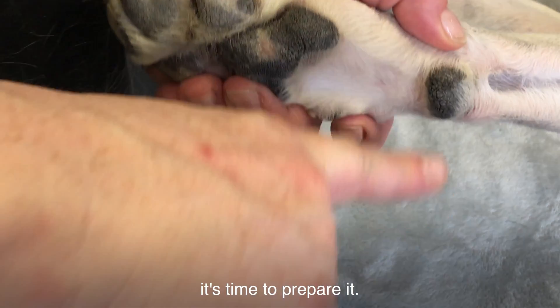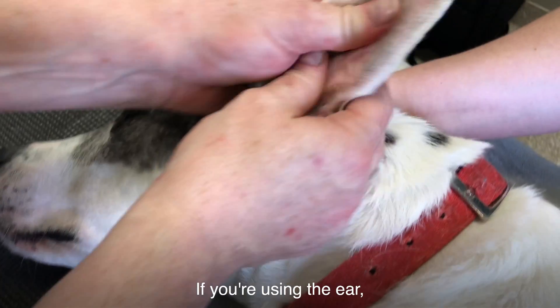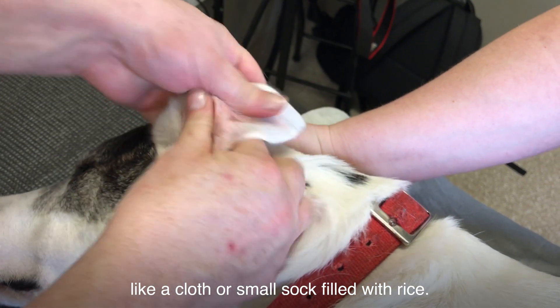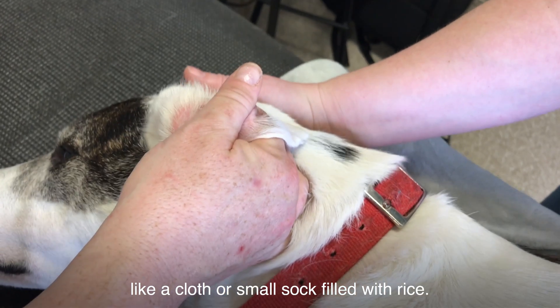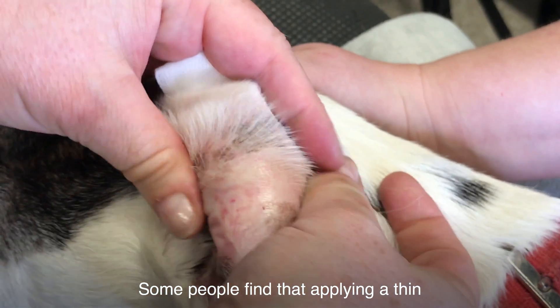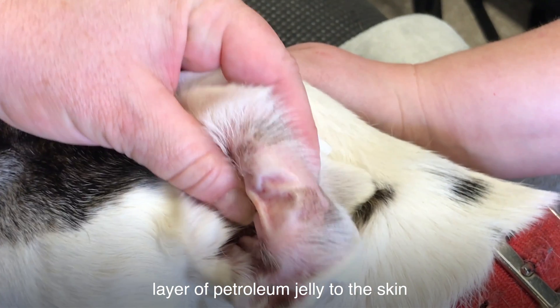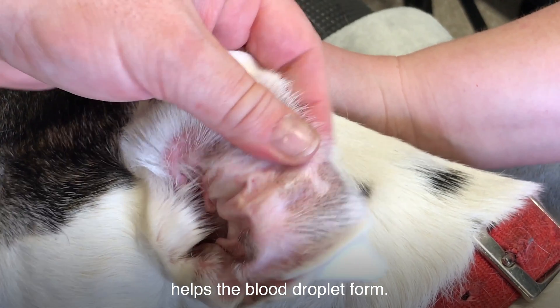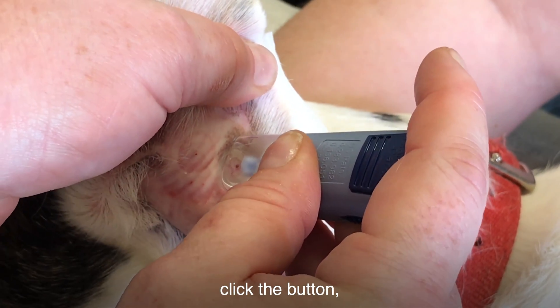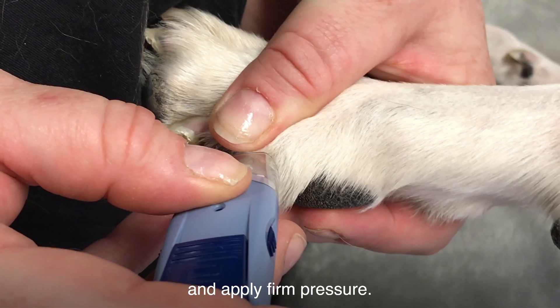Once you've picked the testing site, it's time to prepare it. If you're using the ear, warm it up by rubbing it or applying a warm compress like a cloth or small sock filled with rice. This increases blood flow to the area. Some people find that applying a thin layer of petroleum jelly to the skin helps the blood droplet form. If you're using a lancet device, put it on the testing site, click the button, and apply firm pressure.